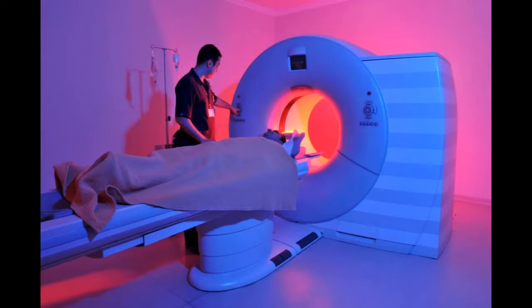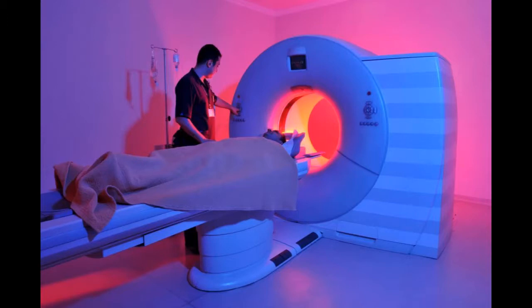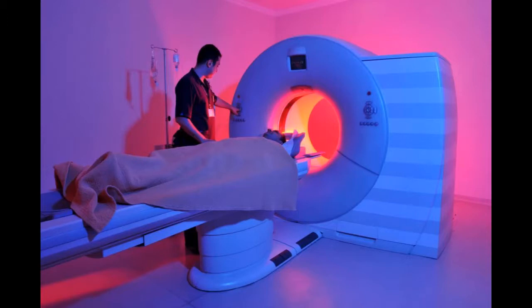MRI is in general a safe technique, although injuries may occur as a result of failed safety procedures or human error.